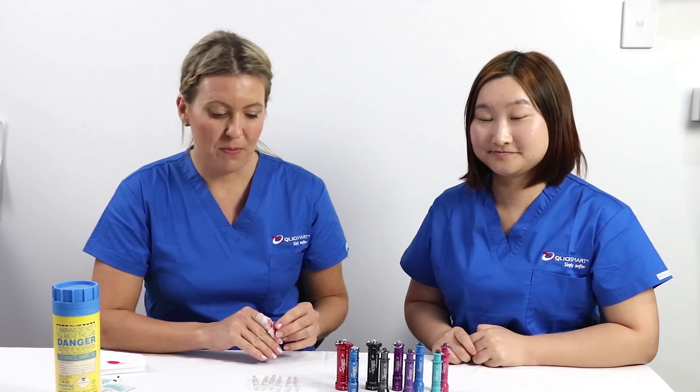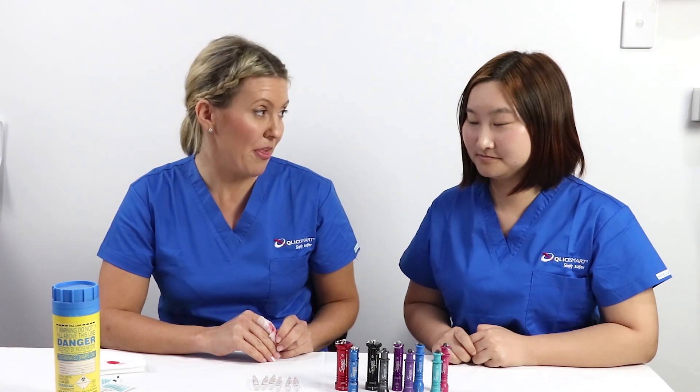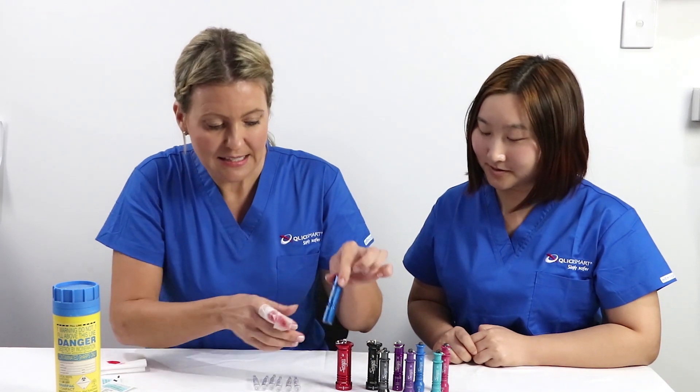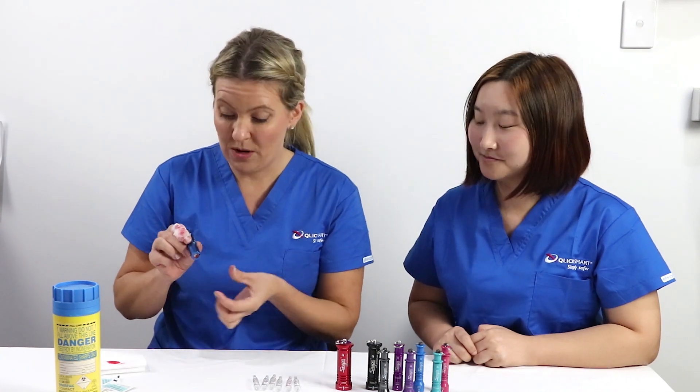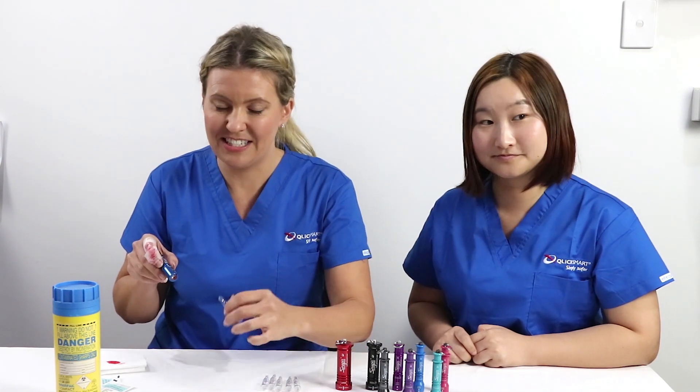Hey guys, I'm back, and I've just heard that the easiest way to open glass ampoules is the Click Smart method. This here is a Click Smart Snap-It glass ampoule opener. If you don't want cuts on your fingers, you're going to want to watch this as I show you how easy it is to use.